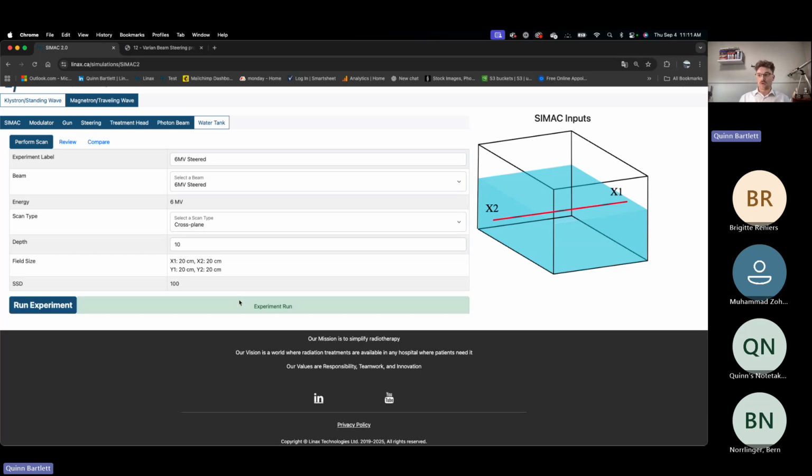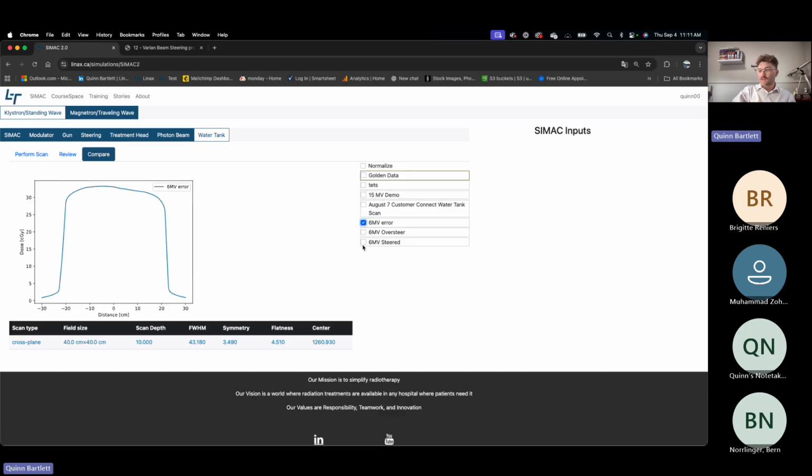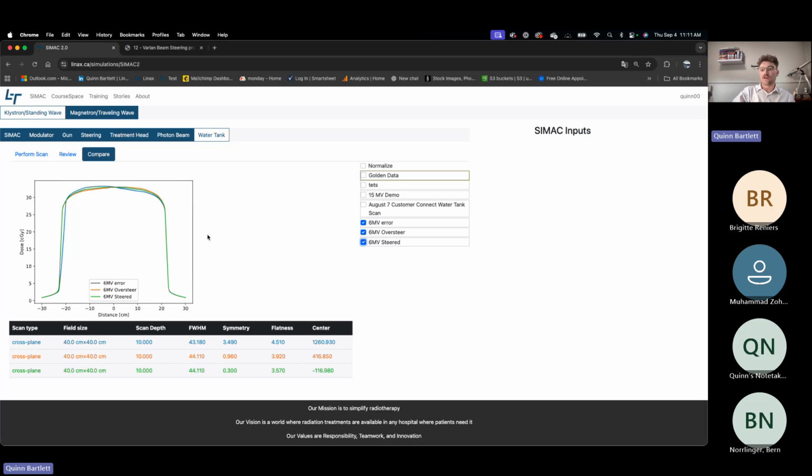In the future, we would love to be able to introduce a randomized error, so that you don't have to find good errors and then find the values to correct them all the time, but we aren't quite there yet. Then we can come to our compare, and so here are three. There's our error, our oversteered, and our steered. And so then you can get a couple more values out as well.